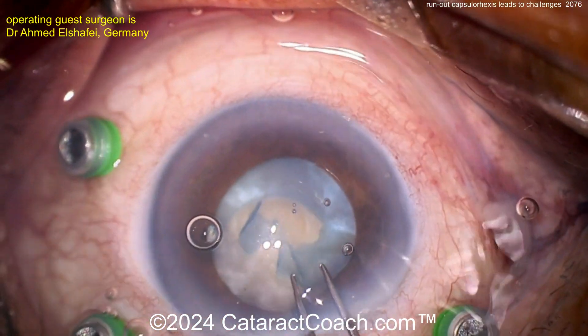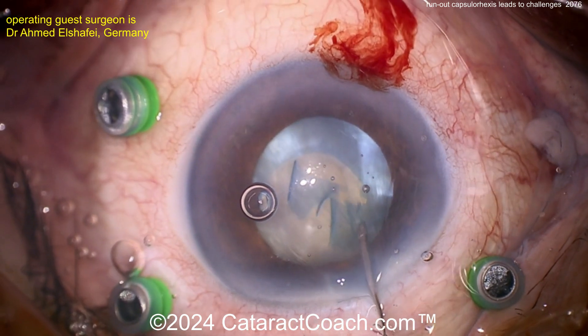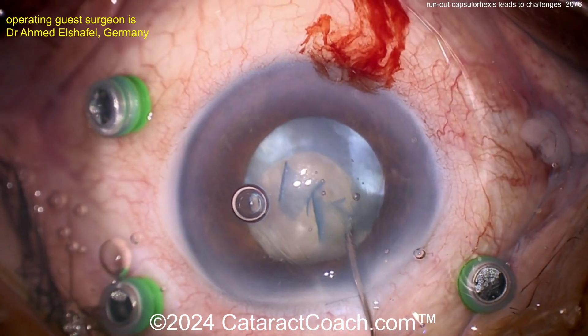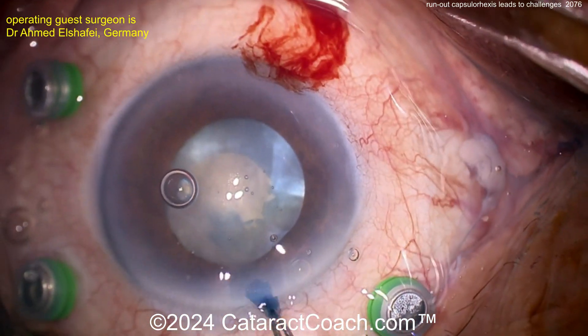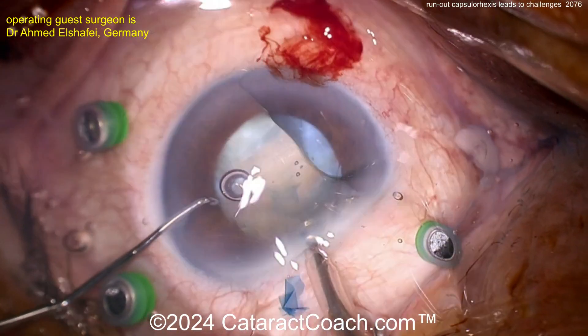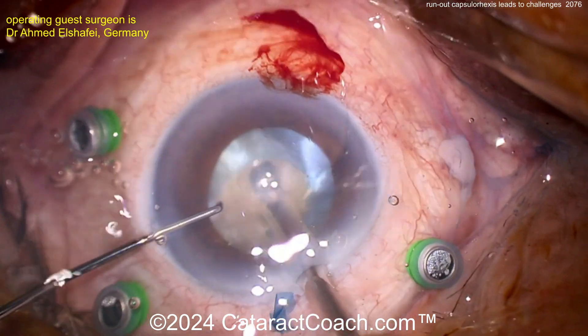So now what? Here comes a cystotome — maybe doing a little can-opener action here to open up that lens capsule a little bit and get a little more access to the nucleus. That's reasonable. Now the phaco probe is going inside the eye. That's a small rexis, and remember you've got some weak edges there where you did the can-opener.